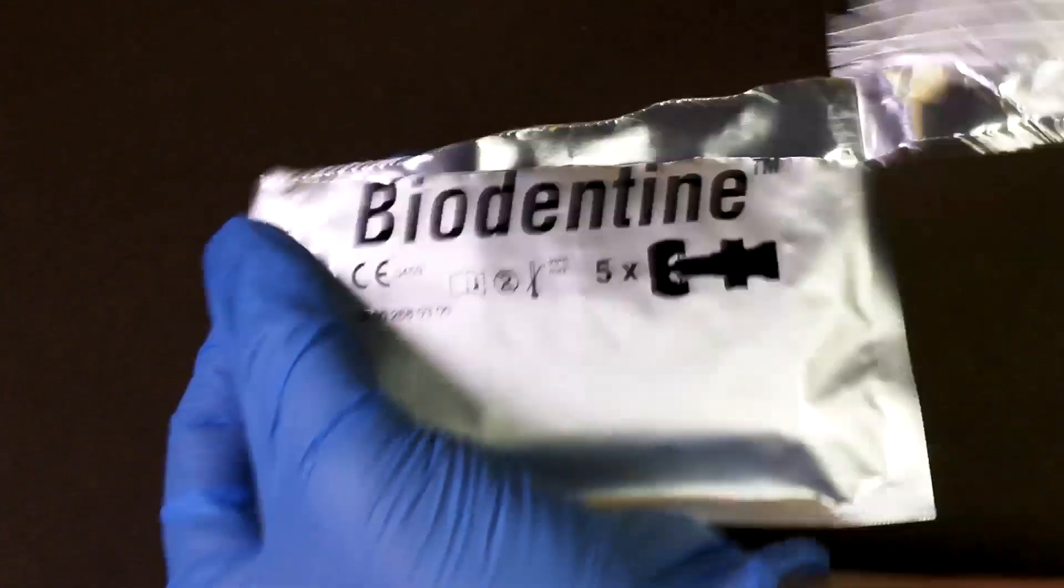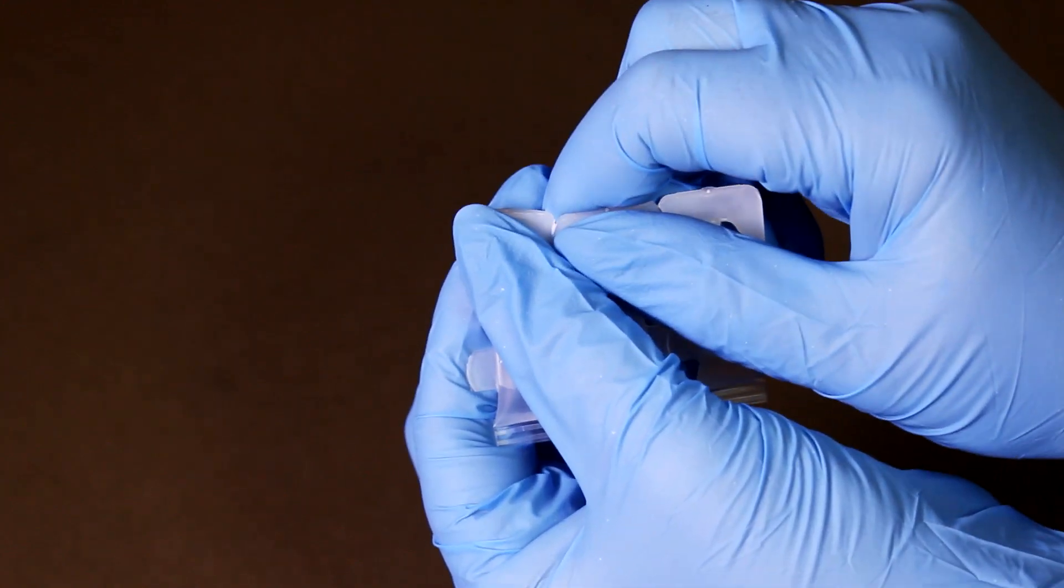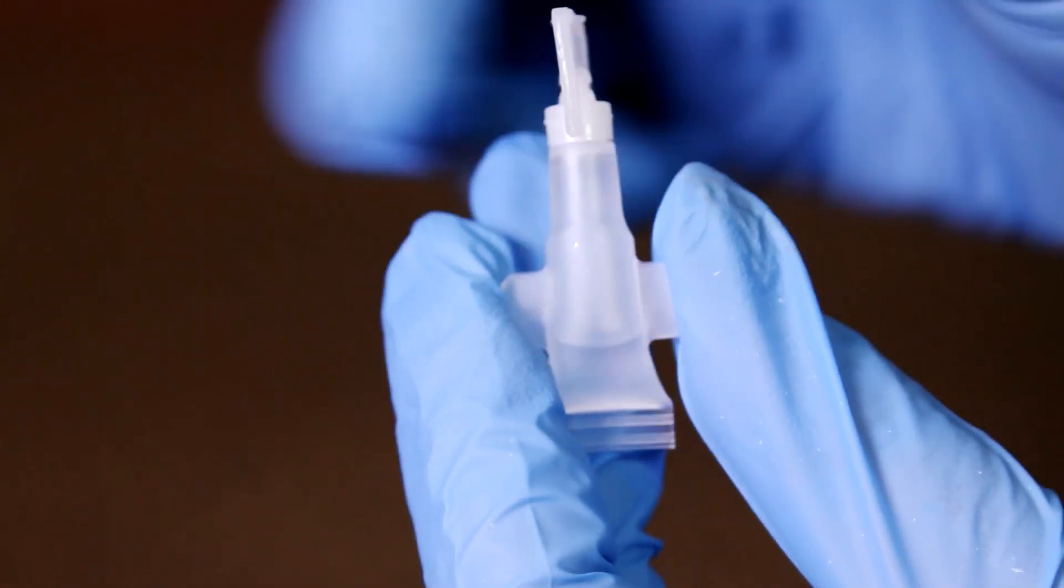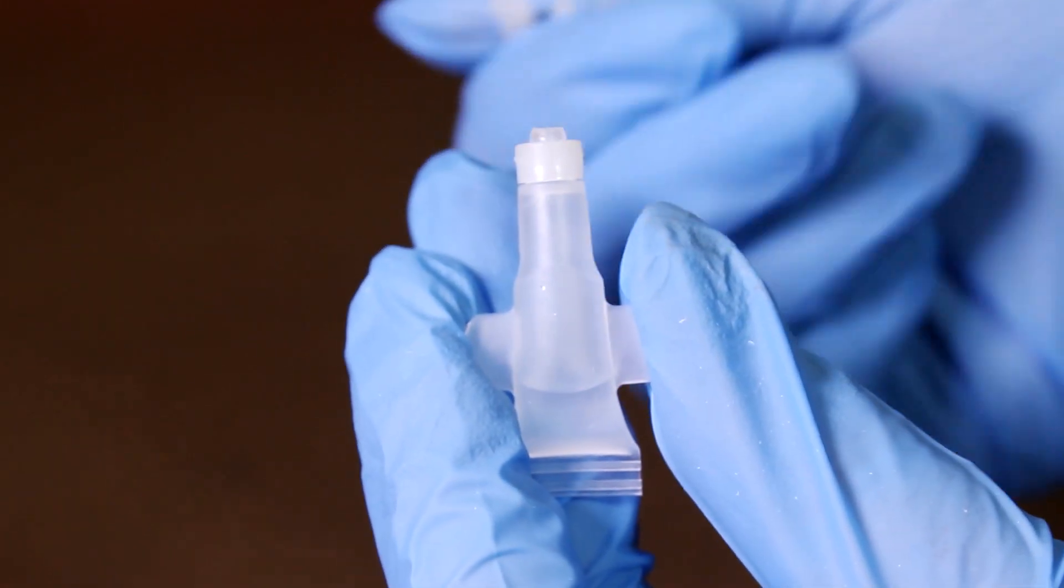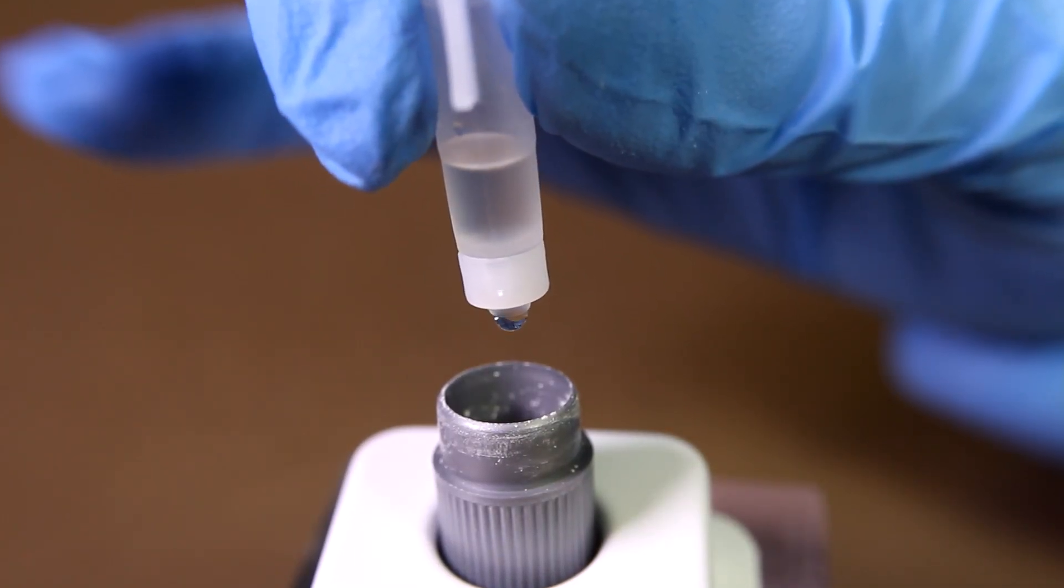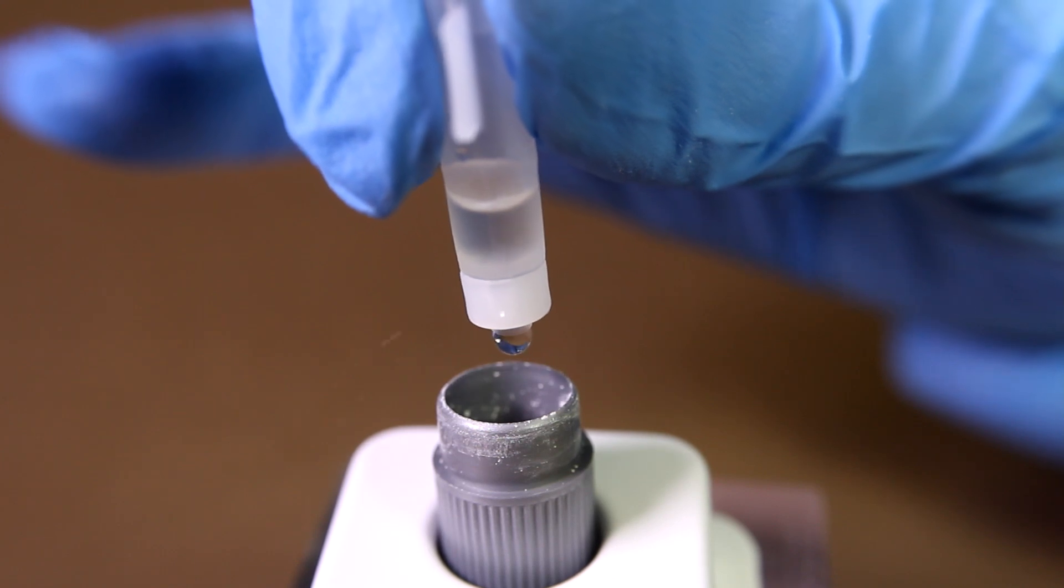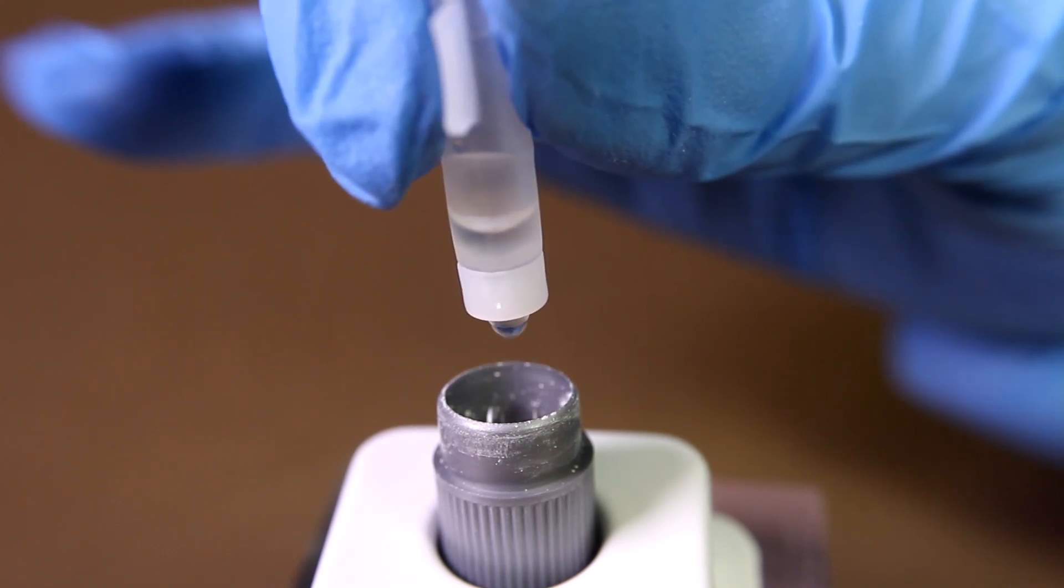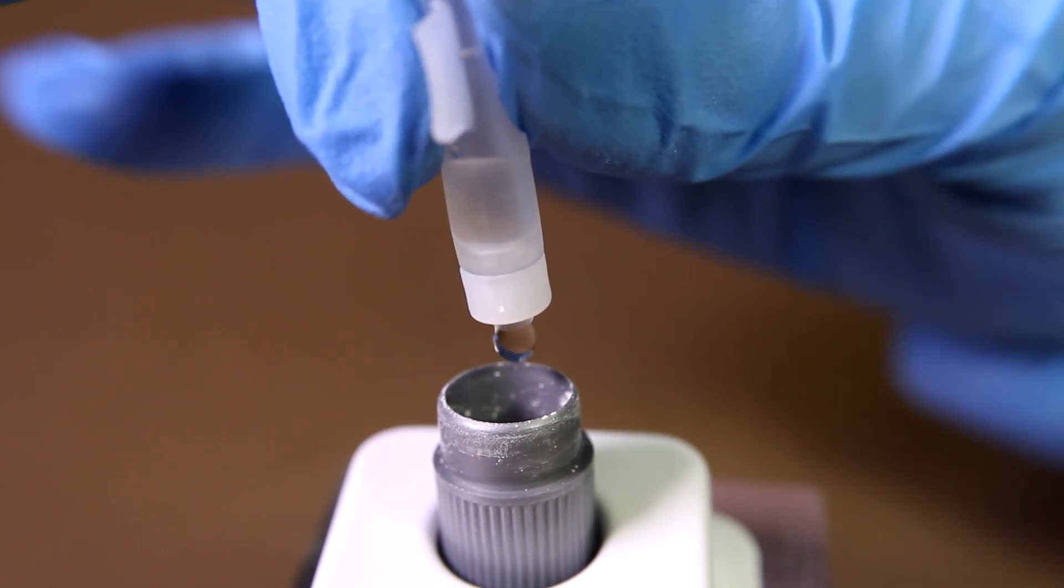Open the pipette package and snap off one pipette. Twist and pull the pin out of the top of the pipette. Then, holding vertically, squeeze the pipette and maintain pressure until 5 drops have been dispensed into the capsule.